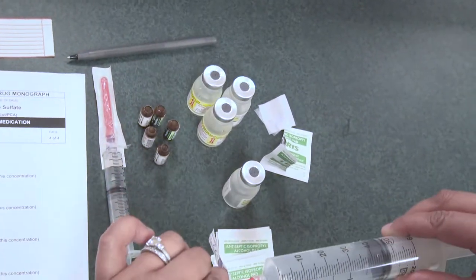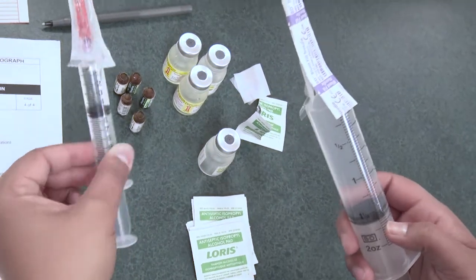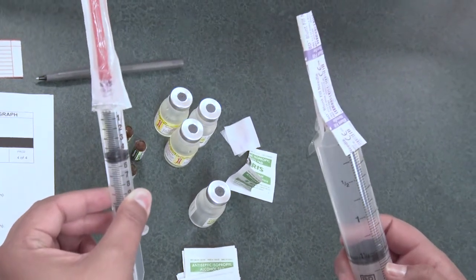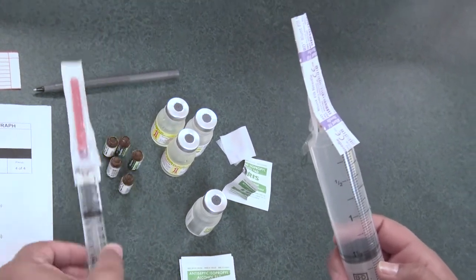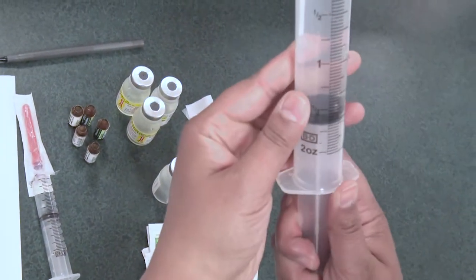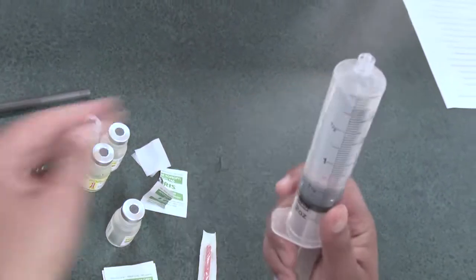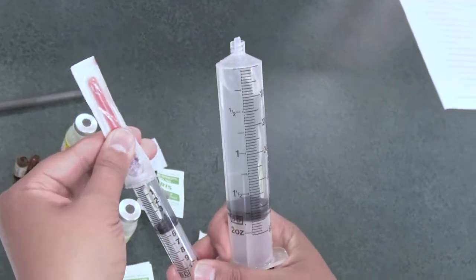Now that I've drawn up my 45 of saline, I'm going to inject my 5 milliliters, which is 50 milligrams of morphine, into this syringe. I'm just going to pull back a little bit so I only have the 5 extra.